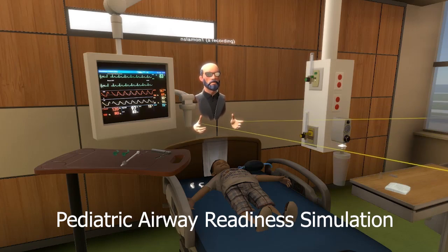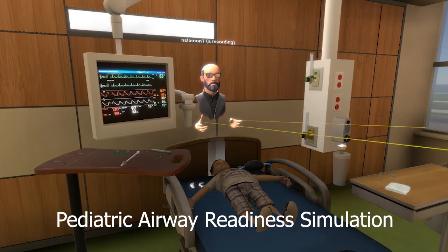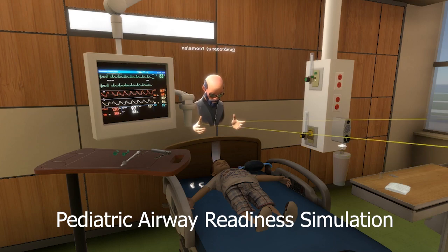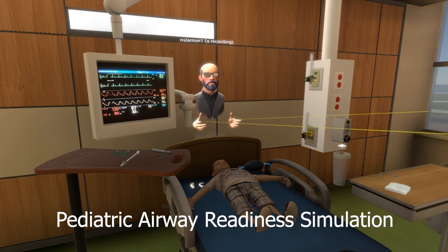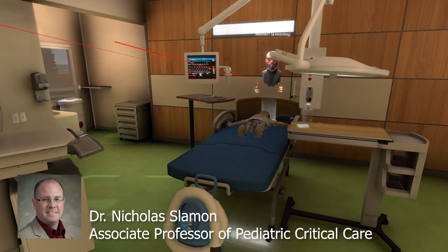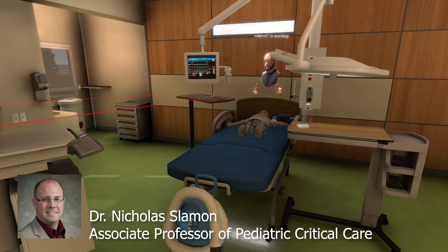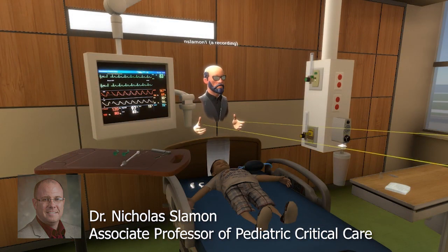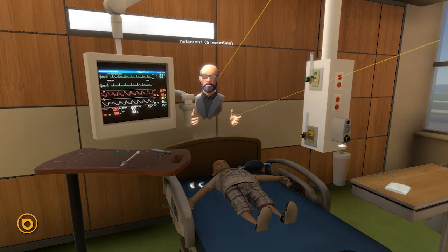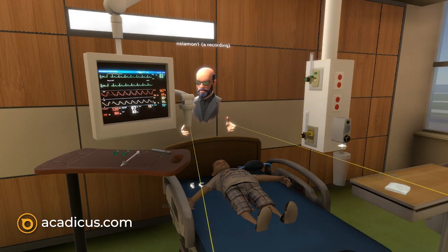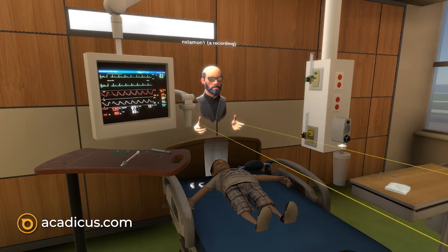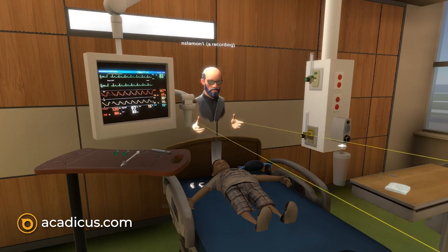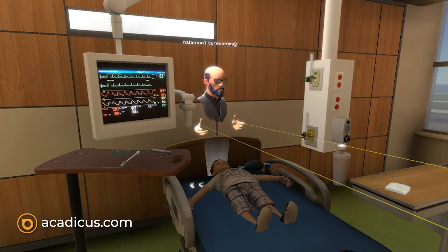Hello and welcome to the Acadicus Pediatric Readiness Airway Simulator. In this simulation, we're going to go over one of the most anxiety-provoking procedures in pediatric critical care: a patient with acute respiratory failure who needs airway resuscitation and eventual intubation. While we won't go over the intubation itself, we're going to go over the room setup and all the equipment you may need to make this procedure as successful as possible.